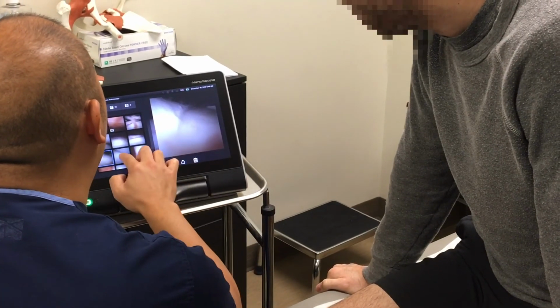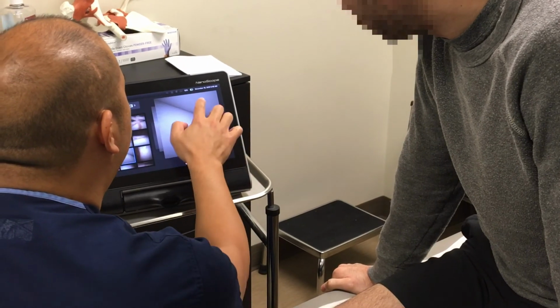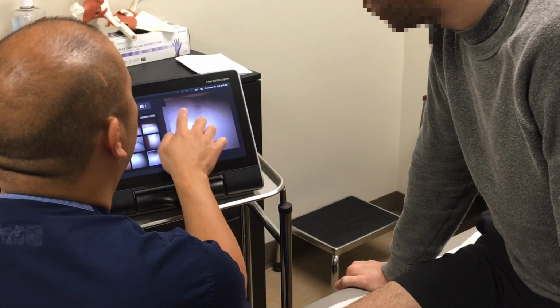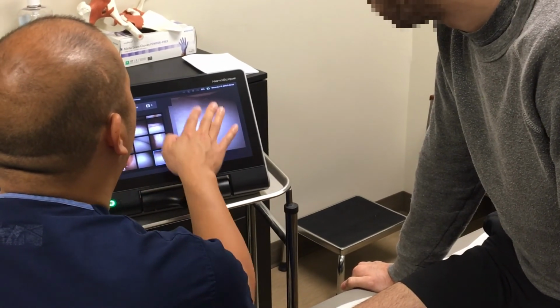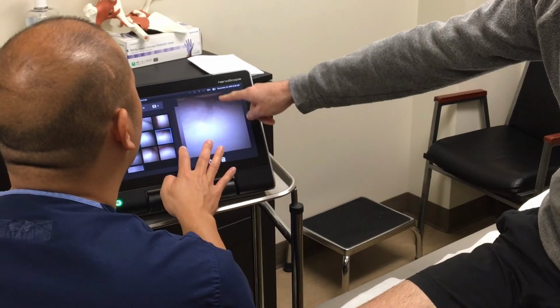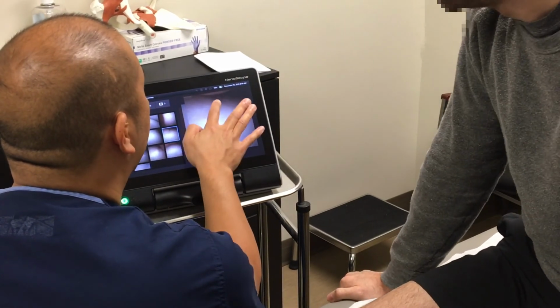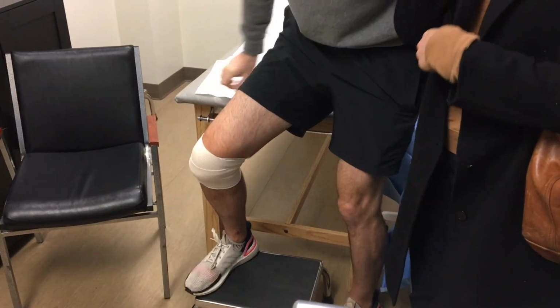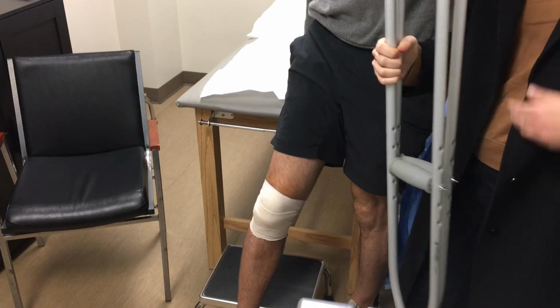Here I am going over with the patient the OATs plug, looking at the contour, and you can see here this is the medial border of the plug that has been healed and well incorporated, so I'm very happy with that. And there's minimal to no step off there, so it's a nice transitional border. Being able to evaluate this with a NanoScope allows me to tell the patient that the plug is healed and he can start his weight bearing and recovery, and the patient is given crutches and guided out of the office.